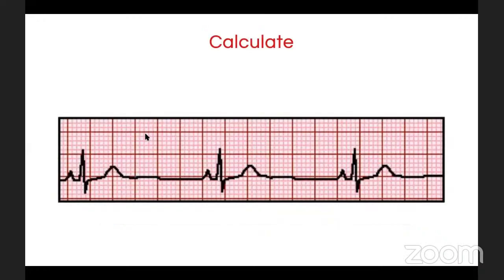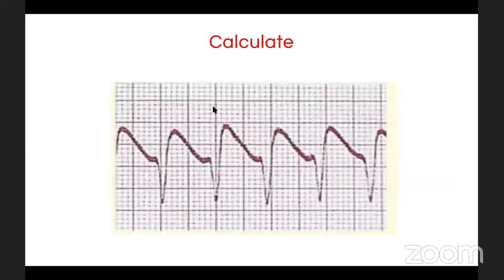أوكي يلا مين يحسب لي هذه؟ نشوف أوضح 2R waves اللي موجودة هنا ونعد كم في box. أوكي ممتاز. 1 2 3 4 5 6، فنقسم 300 by 6 equals 50. ممتاز شكرا شكرا لكم. أوكي ممتاز. أوكي next slide. أوكي الحين هذه يلا calculate.